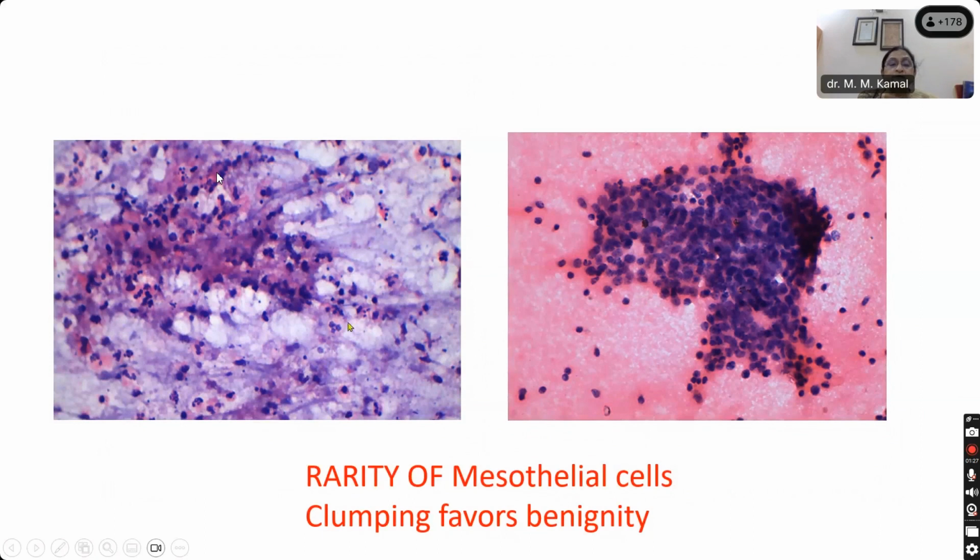Ma'am, this looks like necrotic debris. Necrotic, fatty, cheesy. Yes, ma'am, a necrotic background. What is this? Ma'am, these look like inflammatory cells. Which? Ma'am, this predominantly looks like lymphocytes. Yes, so this is an aggregate of mature lymphocytes. All lymphocytes.